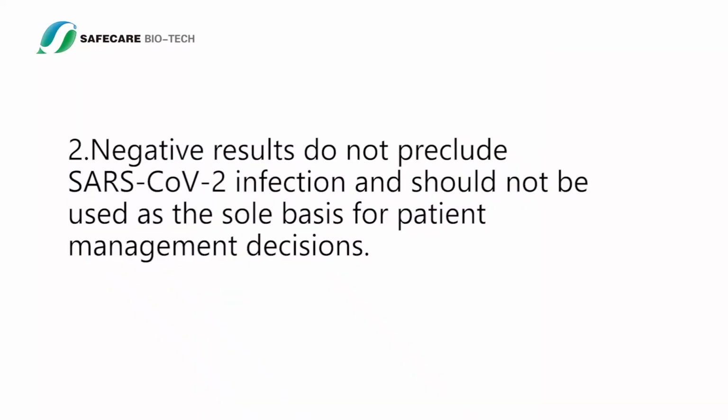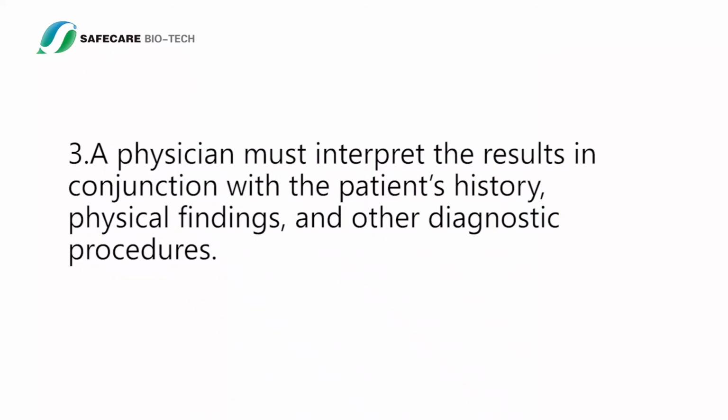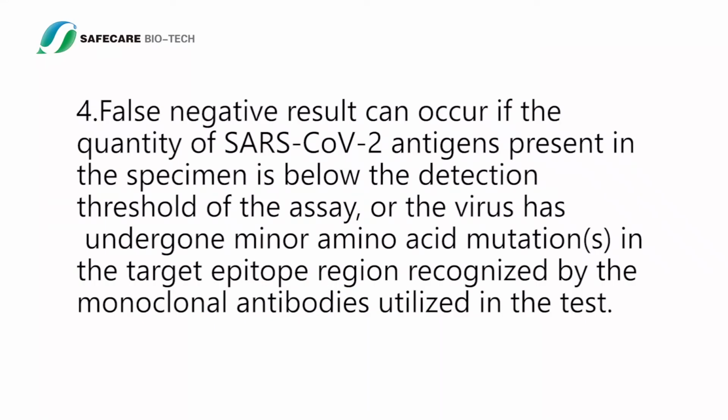Negative results do not preclude SARS-CoV-2 infection, and should not be used as the sole basis for patient management decisions. A physician must interpret the results in conjunction with the patient's history, physical findings, and other diagnostic procedures. False negative result can occur if the quantity of SARS-CoV-2 antigens present in the specimen is below the detection threshold of the assay, or the virus has undergone minor amino acid mutations in the target epitope region recognized by the monoclonal antibodies utilized in the test.